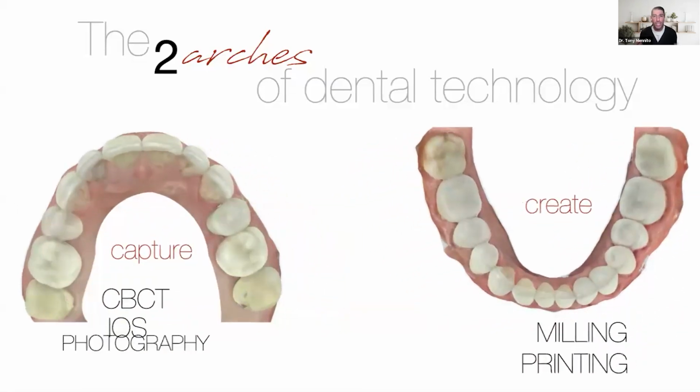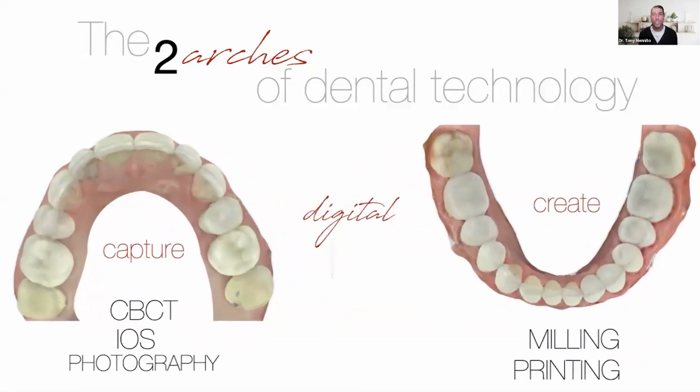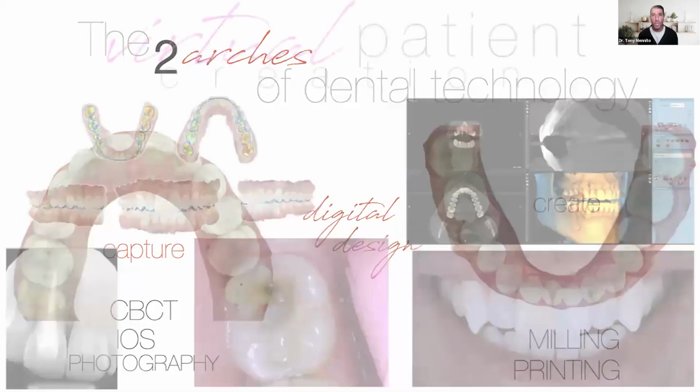And then the articulation that brings these two arches together is digital design. Digital design is a bit of a sticky point for a lot of dentists who are trying to implement technology, because maybe they don't want to have to mess with the digital design. But the reality is there are a lot of opportunities to outsource this at a really reasonable price, or you can purchase software or use free software to do the digital design yourself. So there are a lot of different options for digital design. Once again, I will go more in depth on that in Las Vegas in about a month.